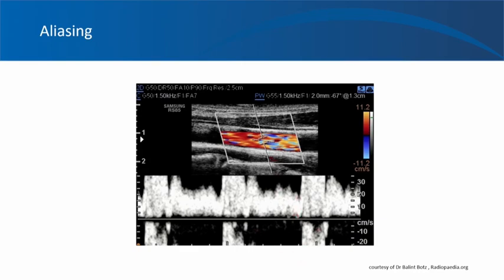And similarly, you can use either of these modes to look at the aliasing. If you're calculating velocities, pulse wave Doppler becomes important. And this range of colors is like wrapping around. So if you look at the color bar here, it wraps around all these colors.